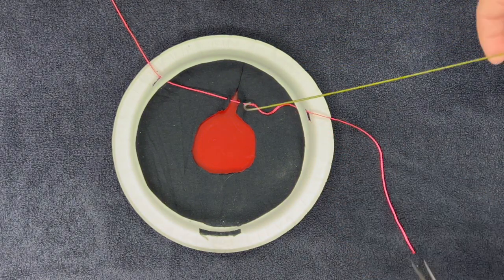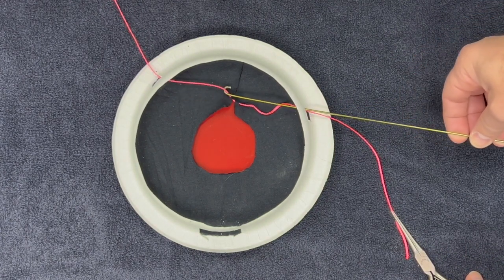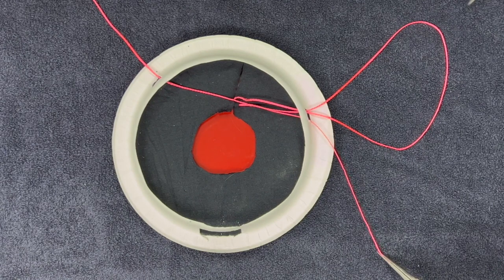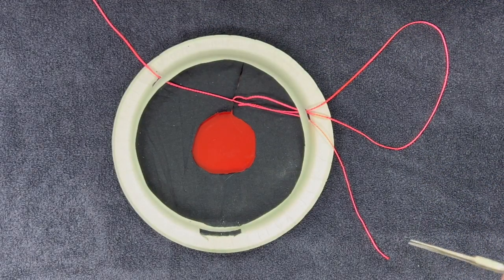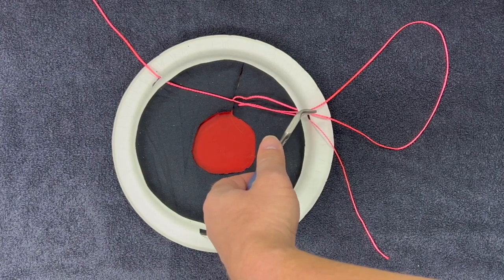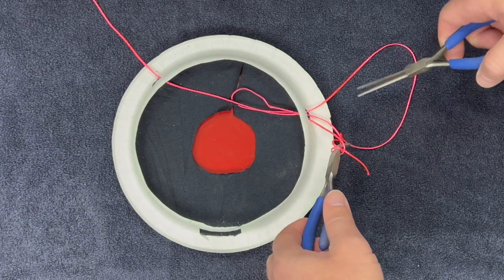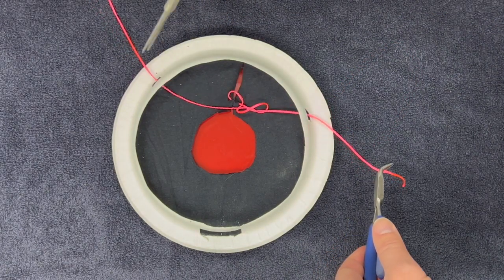Now we'll take a positioning hook, go in through the paracentesis, and grab the suture between the distal iris defect and the exit wound. We'll hook the suture and draw it back out of the paracentesis. We always orient the suture the same way: the original end at the bottom, the middle strand goes through the peripheral iris defect, and the upper strand goes all the way through and outside the eye. I like to use a straight and a curved tyer — point the curved tyer out as if pointing through the paracentesis. Grab the middle strand and do two throws, then grab the free end.